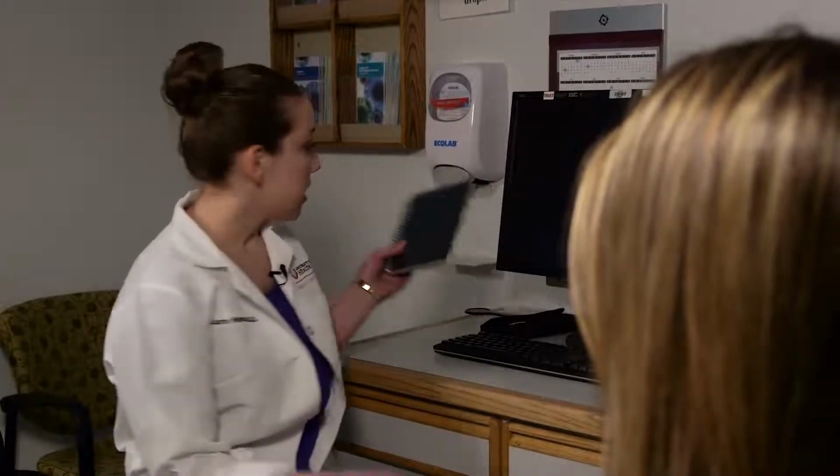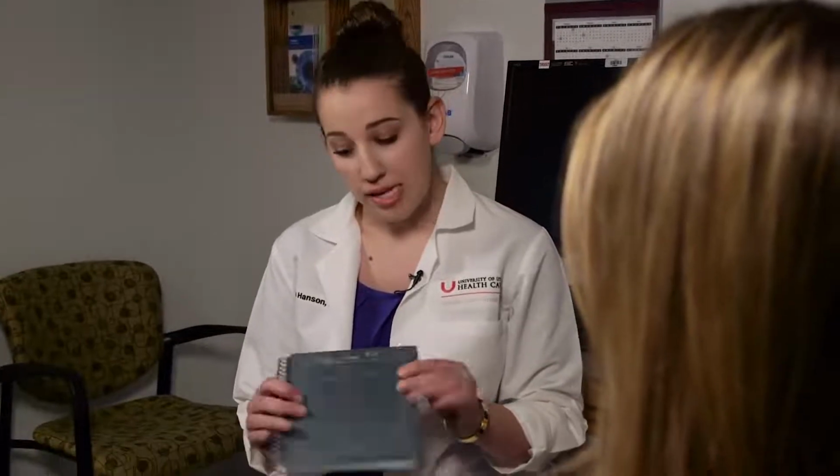We're going to start today with the Hardy-Rand-Rittler pseudo-isochromatic color plates. This is one way that you can test color vision. The nice thing about these plates is that it can screen for red-green defects and for blue-yellow defects. The Ishihara color plates primarily just screen for red-green defects.